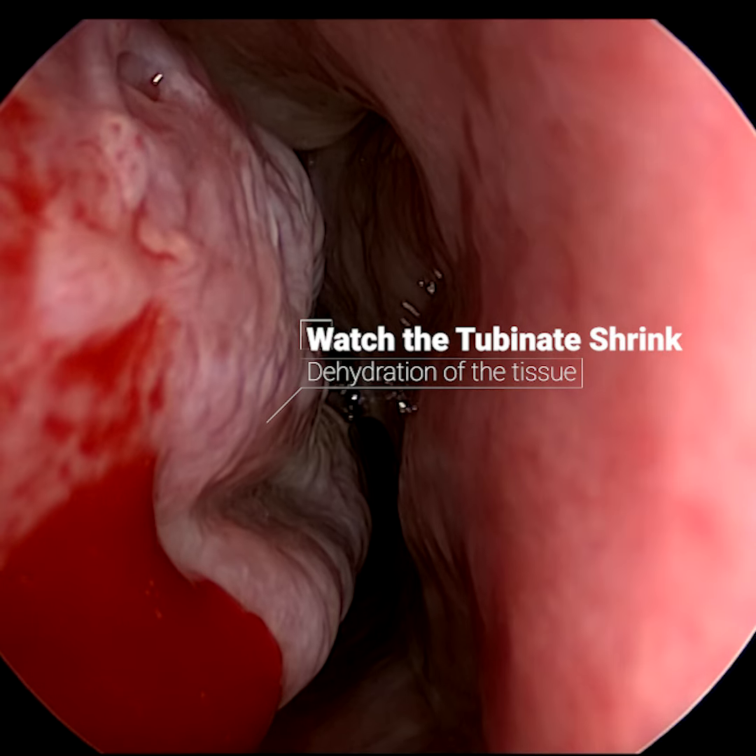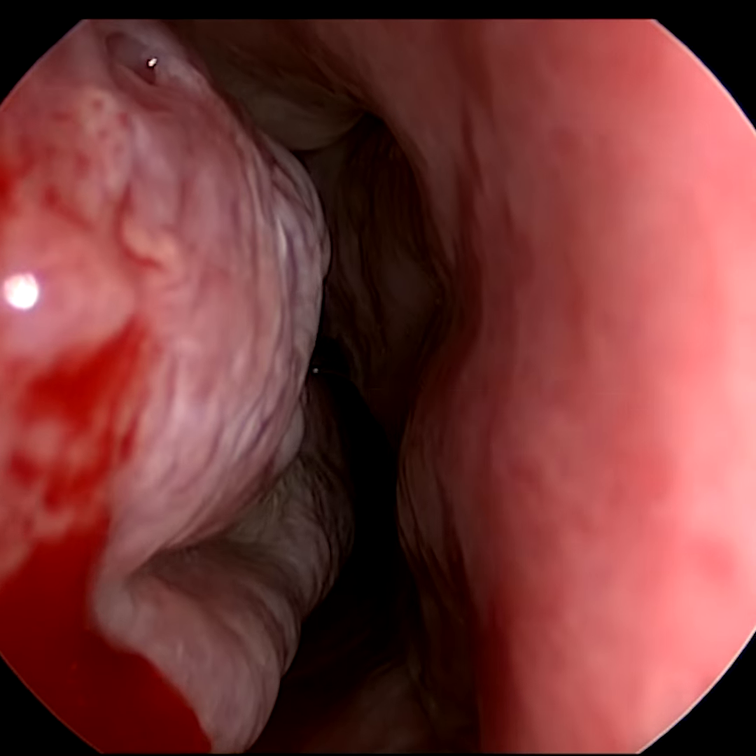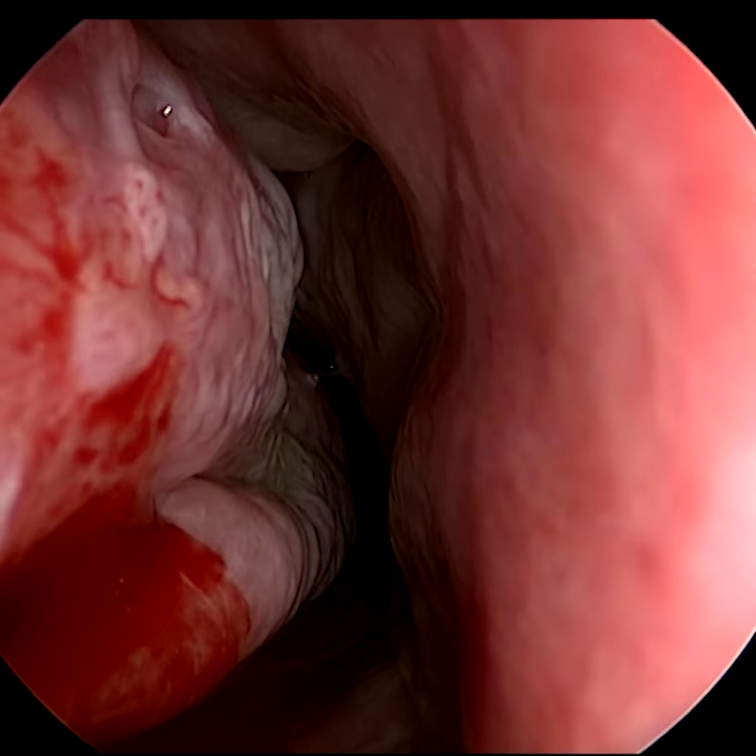Here you can see the turbinates shrinking down in real time and you can already see that the nasal airway has opened up and this patient can already breathe better.